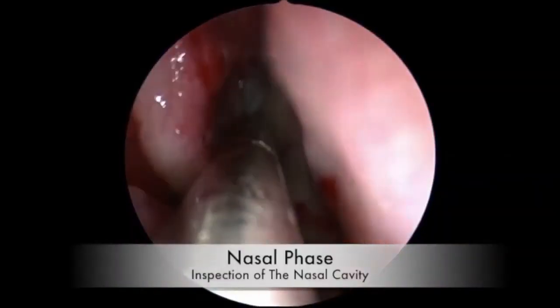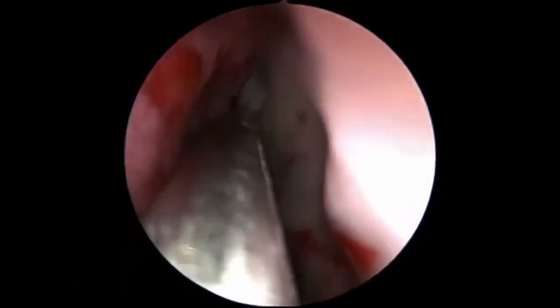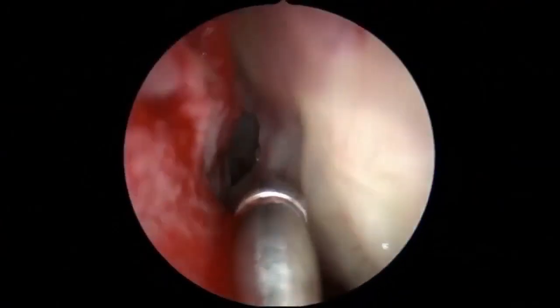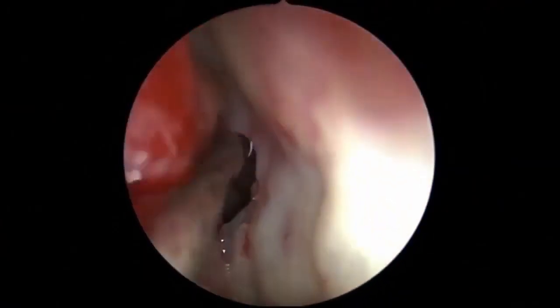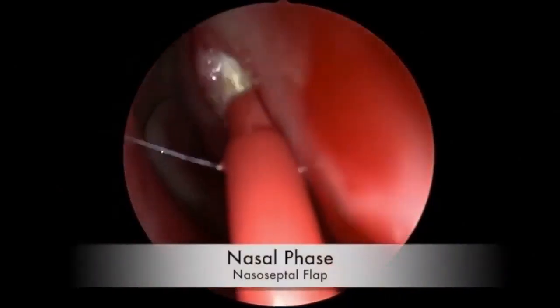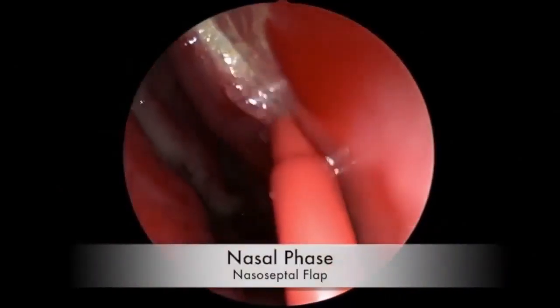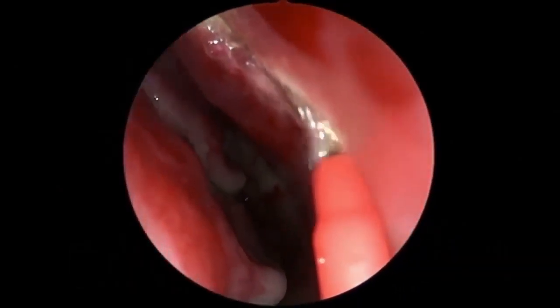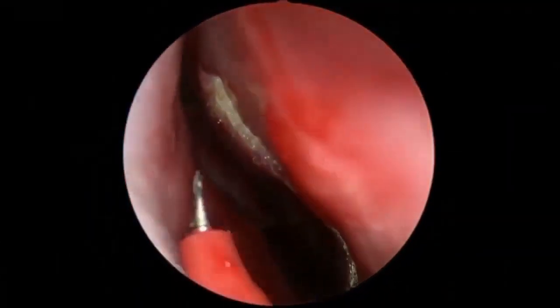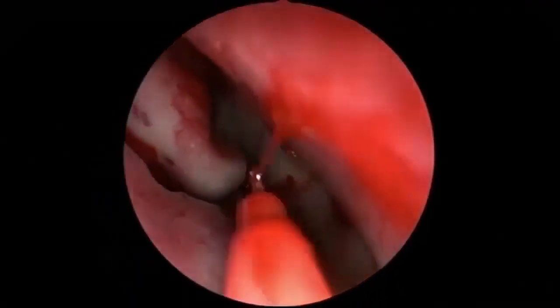The first phase of the operation, working medial to the middle turbinates, we identify the ostium of the sphenoid sinus. You can see the choana. A mushroom punch is used to enlarge the ostium of the sphenoid sinus. And then a vascularized nasoseptal flap is harvested by making superior and inferior cuts, as well as an anterior cut at the level of the middle turbinate.